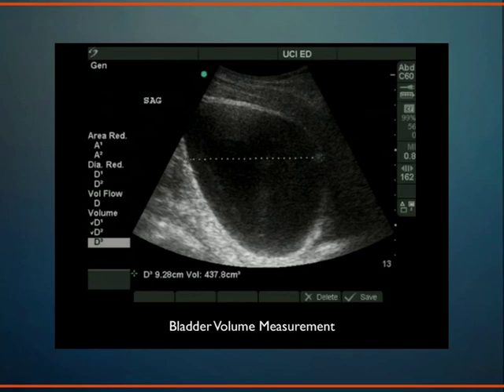Yes? When would you want to measure the bladder volume? Yeah, why do you care about measuring the bladder volume? It's something that we want to know about actually quite frequently in the hospital, because it applies at all ages. In little babies who have a fever, we want to basically cannulate their bladder, put a catheter in their bladder to get the urine out, to send it off for urine culture. Well, some of them just urinated in their diaper, and you would unnecessarily put them through the procedure of a bladder catheterization, which is painful. So you could avoid that unnecessarily; you have to wait until the bladder fills up, basically. So I train my nurses to do this, and they take a peek at the bladder before they bother putting a catheter into a small child.